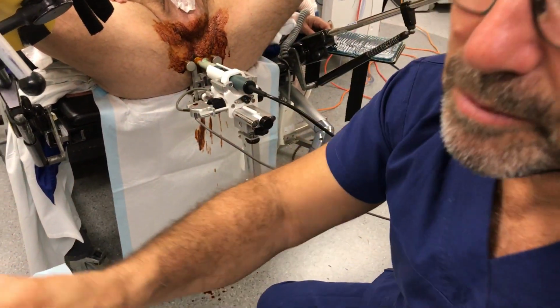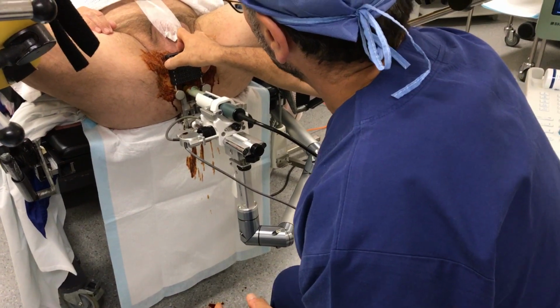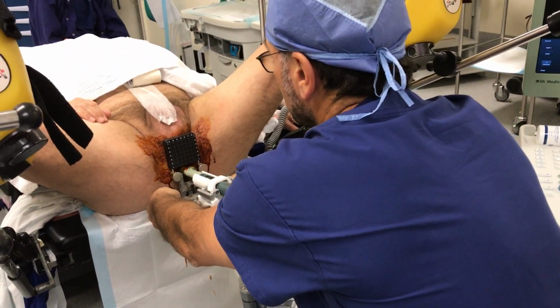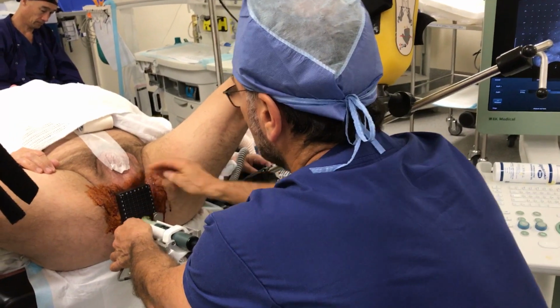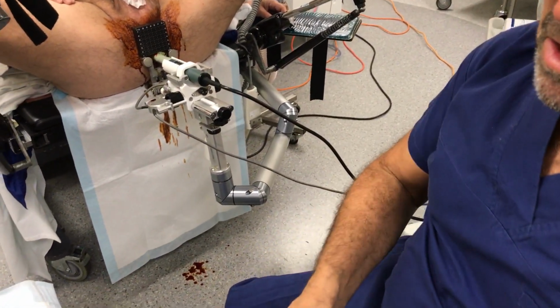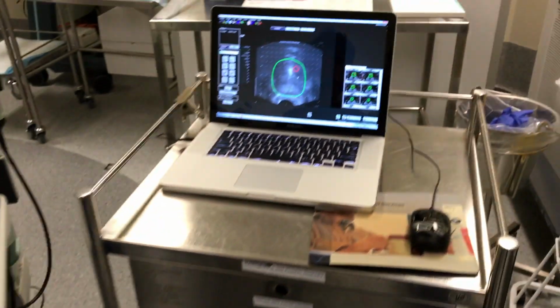And clean the scrotum, put a bracket in.